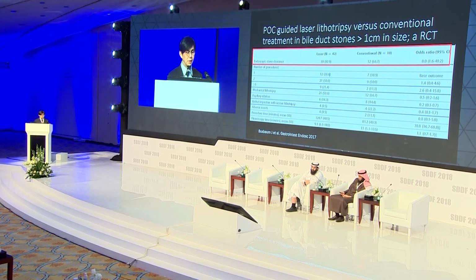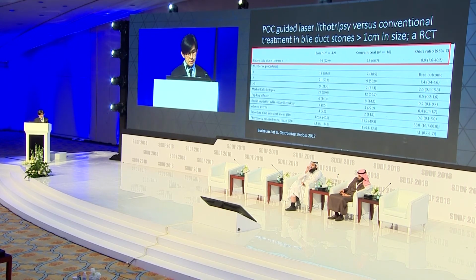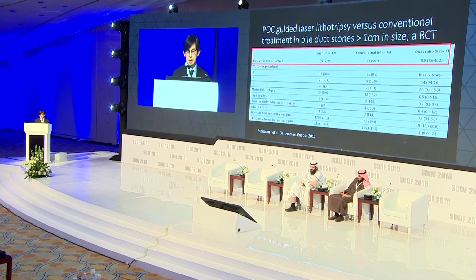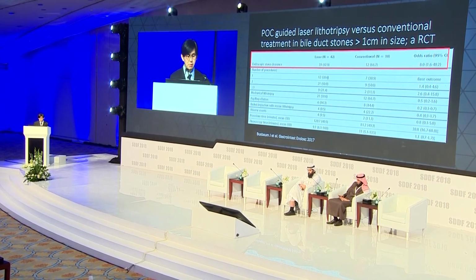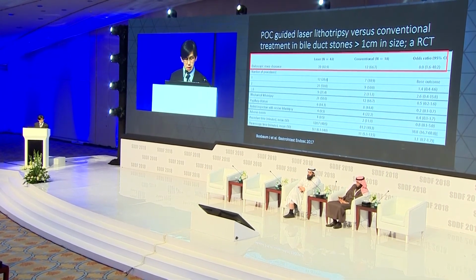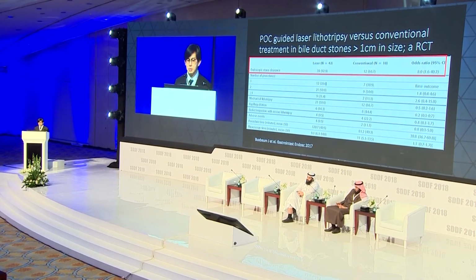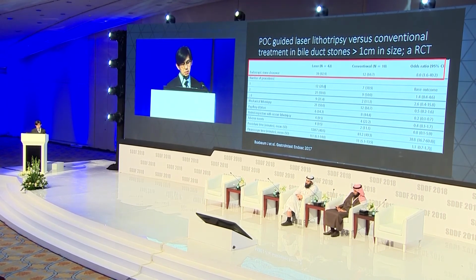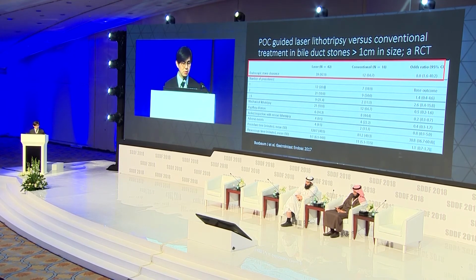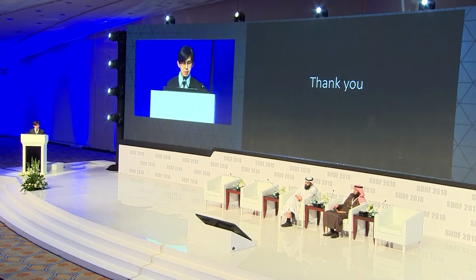And with the use of laser, more sessions were required. The only other difference being in the conventional group, more papillary dilation was used, and there were more basket impactions needing rescue lithotripsy. There was really no major difference in other outcomes. I think this only RCT confirms that POC guided laser therapy in bile duct stones is associated with higher stone clearance rates. And with this, I end my presentation, and thank you very much.